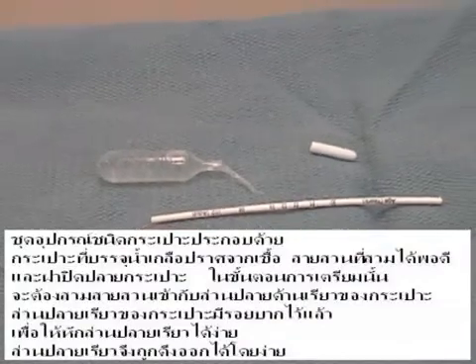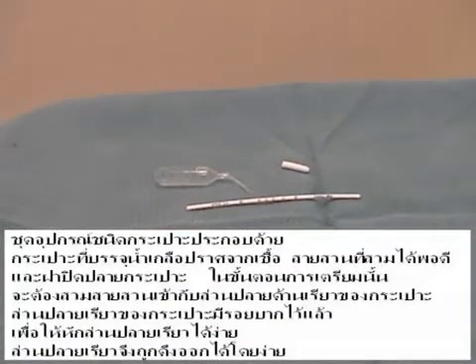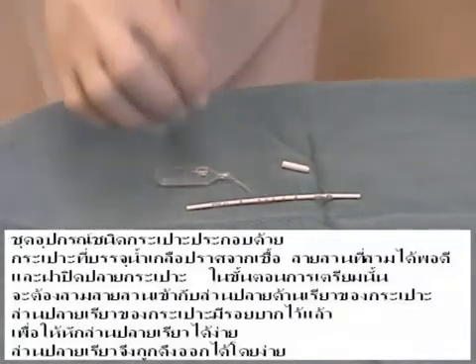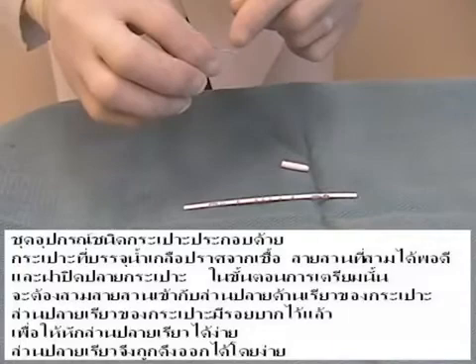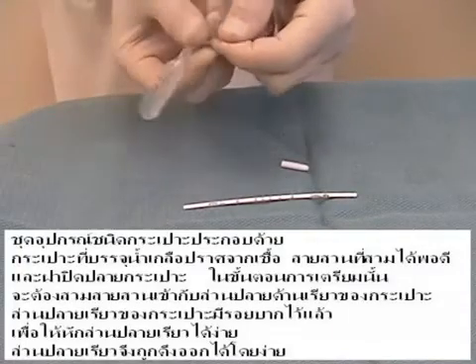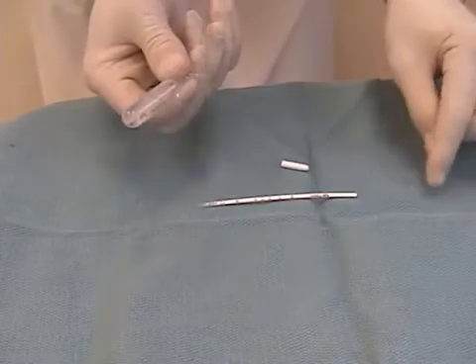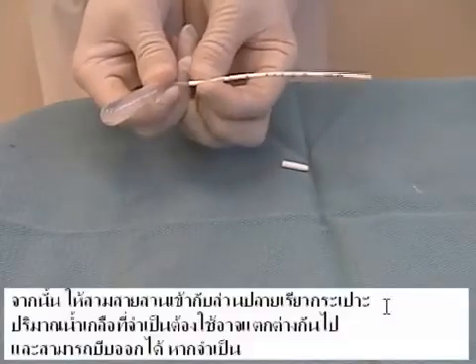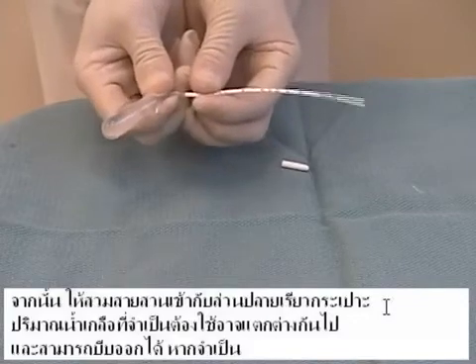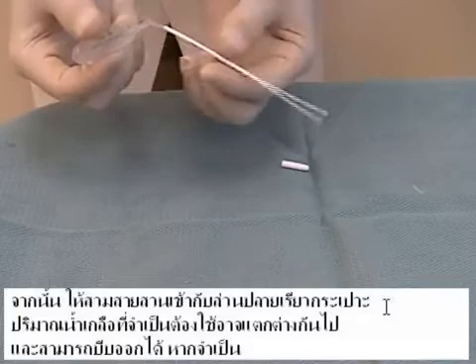The bulb aspiration kit includes a sterile pre-filled saline bulb, a friction fit catheter, and the bulb cap. In preparation, the catheter must be placed onto the tapered end of the bulb. The tapered end of the bulb has been pre-scored to allow easy detachment of the tapered end. The end is simply pulled off. The friction fit catheter then slides onto the tapered end of the bulb.